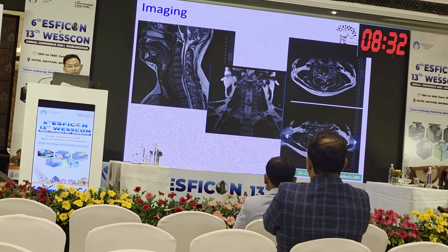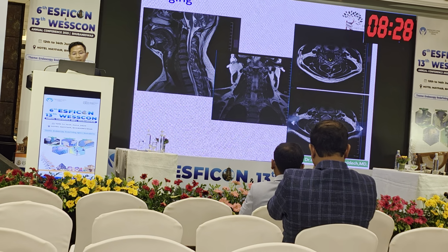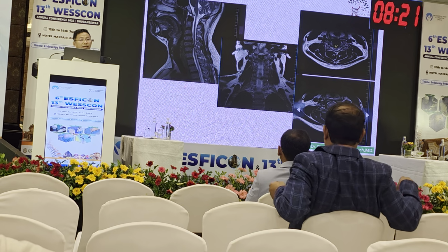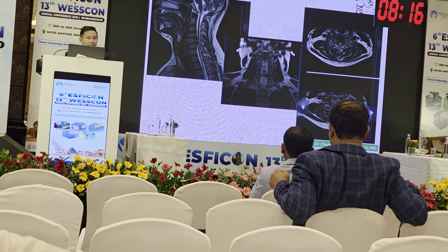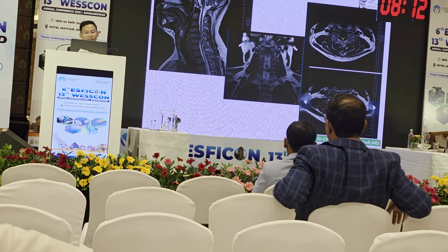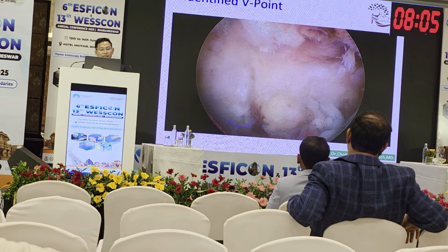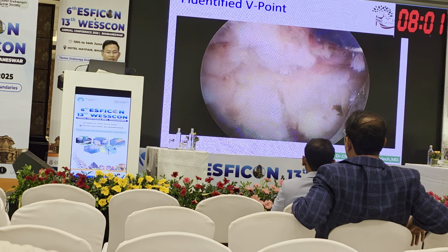This is the MRI. You can see the myelopathy occurs where this rupture is. Maybe for this case he is lucky because the rupture is more central, not more lateral, not more medial. My diagnosis is CSM and I plan to do my procedure. Okay, I'm lucky the video is shown.